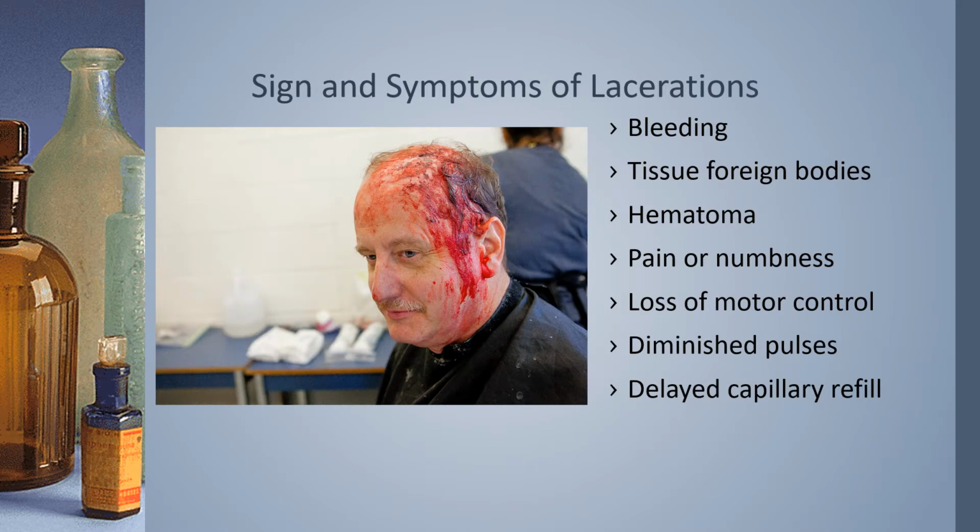It's really interesting to know that the basic principles of laceration repair really haven't changed in the last century, but we actually have some really great therapeutic options that are now available and a lot more innovative and rigorously studied. We have the development of topical anesthetics, tissue adhesives, and fast-absorbing sutures that has made the management of lacerations much less traumatic for the patient. And now we have the use of procedural sedation for some more difficult lacerations and for the extremely anxious child. Mind you, most of these fancy things may not be available to you in clinic.